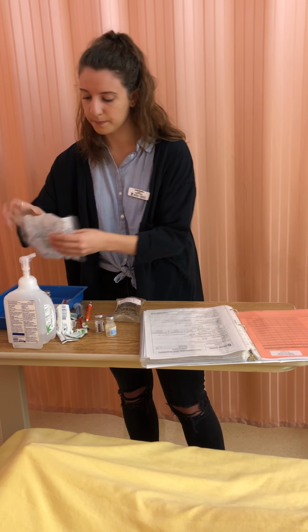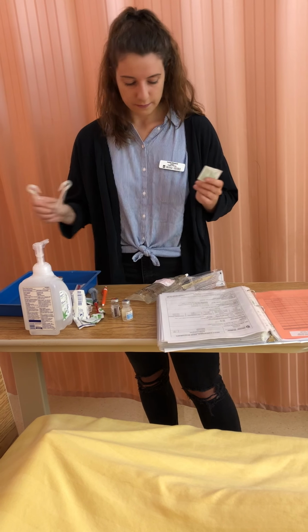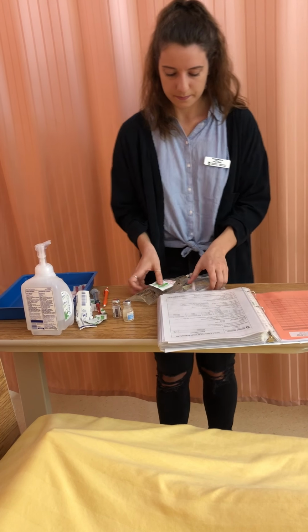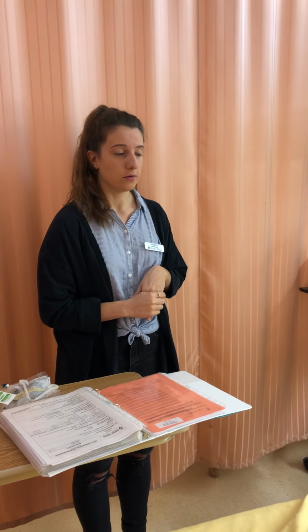So I have my tubing, I have my tape for my tubing, I have my mini bag, I have my swab. Okay. So I'm entering the room now. I'm doing hand hygiene and a general survey, so nothing's on the ground, nothing's really in the way. My patient's in no distress or anything.